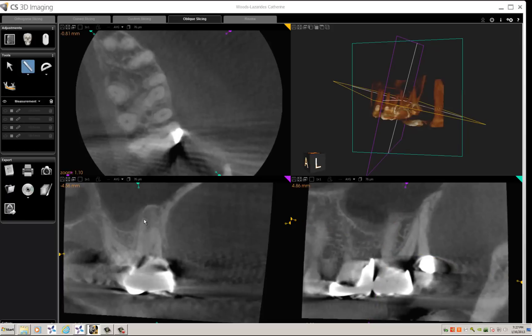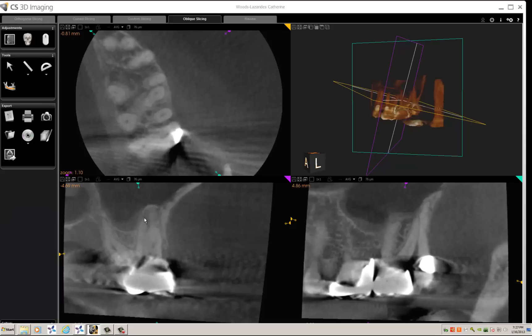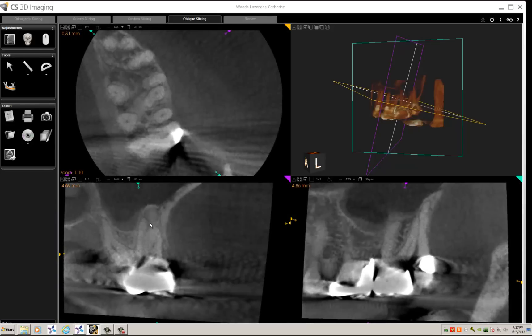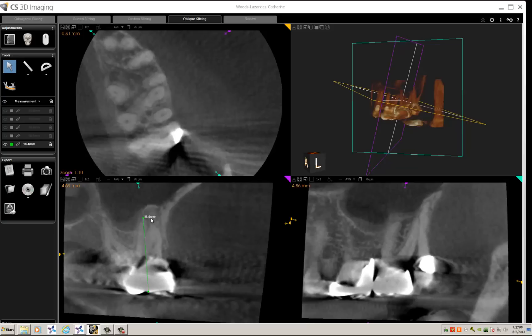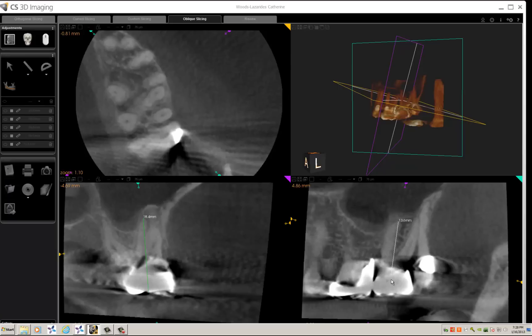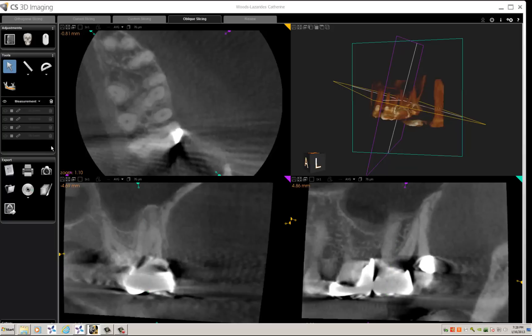I'll change the angulation of the coronal slider slightly as well, and that gives me another view. It's worthwhile getting your measurements in both the coronal and sagittal views and comparing them if there's any difference. Here I can see the apices of the MB2 canal. I select the measure tool and come down to 18.4 millimeters in the coronal view, then 18.2 millimeters in the sagittal view.